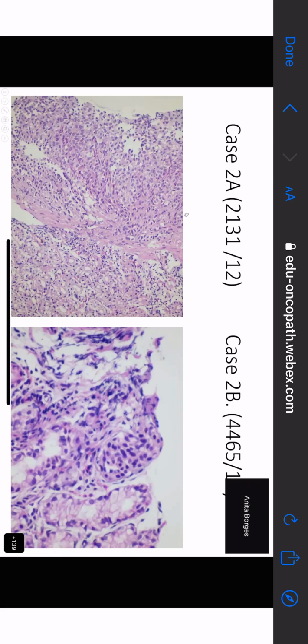There are no glands below the muscularis because it shows some sheets and nests of cells. All right. Dia, do you see glands in this? Ma'am, in case number 2A, on the right hand side, I can see glands which are normal glands. Ma'am, this portion. Absolutely right.